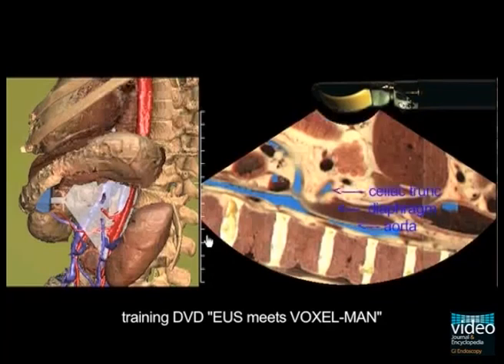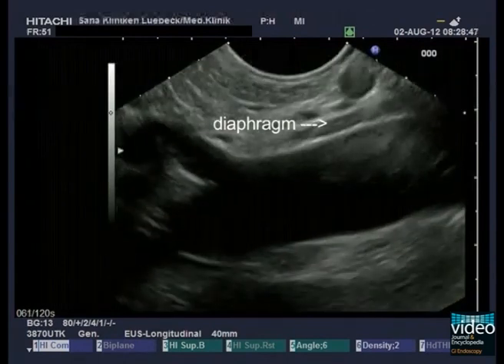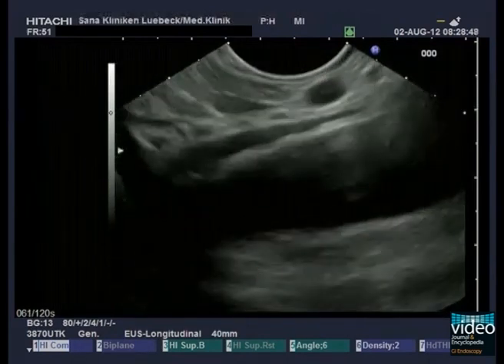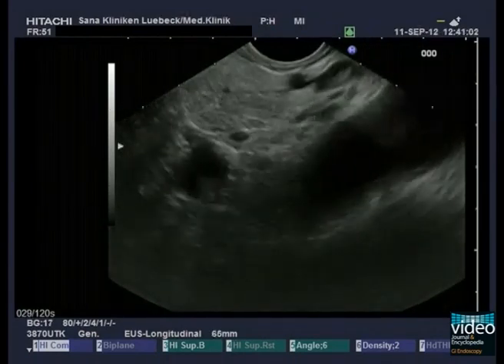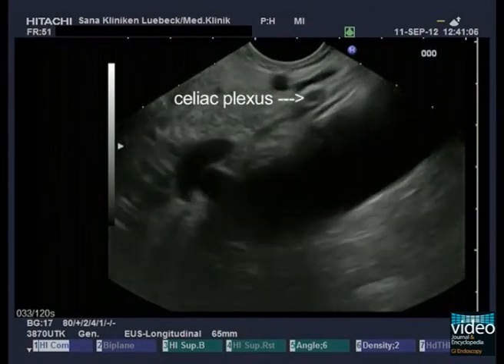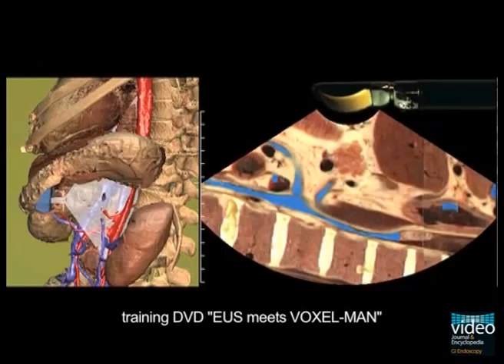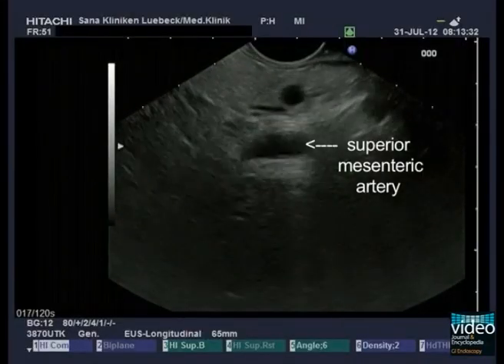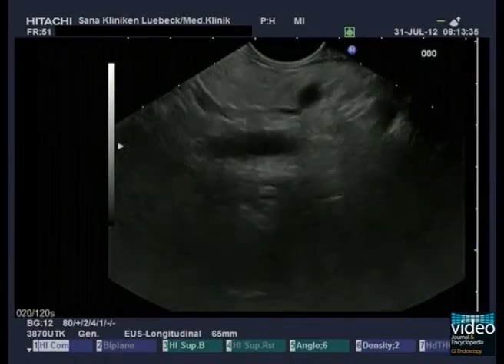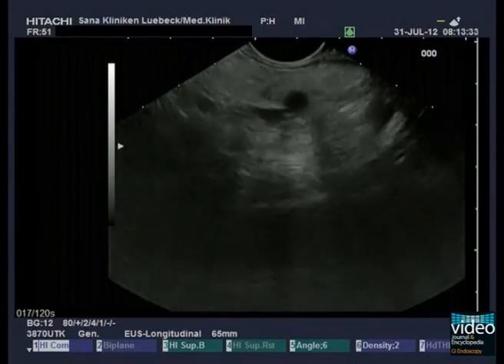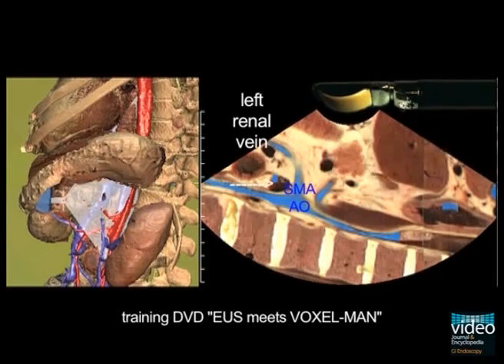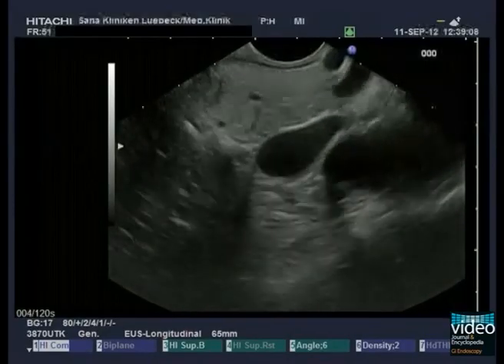Cranially to the celiac trunk, in front of the aorta, the echo-poor diaphragm appears. Close to it, the pearl-like celiac plexus can be seen and should not be mistaken for lymph nodes. A few millimeters caudally, the origin of the superior mesenteric artery is visible. Due to the longitudinal axis of the vessel, this artery can be depicted almost completely. In between the superior mesenteric artery and the ventral wall of the aorta, the crossing left renal vein is in sight.